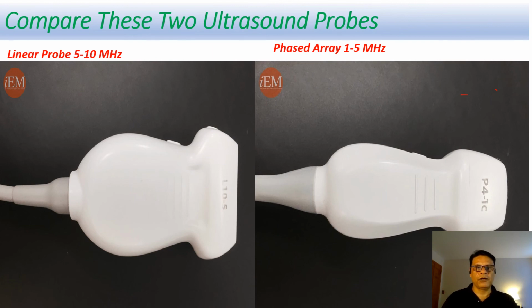See the visual comparison: footprint is large as compared to this one, footprint is small and narrow.